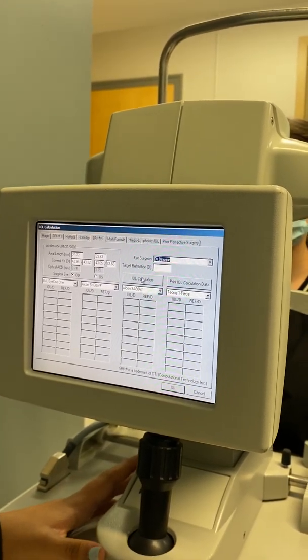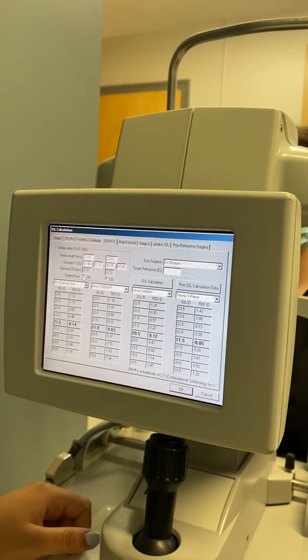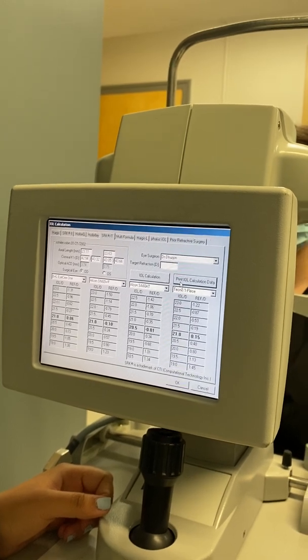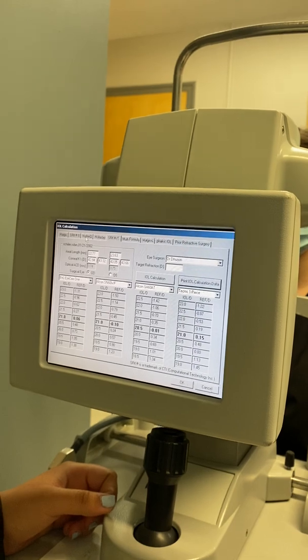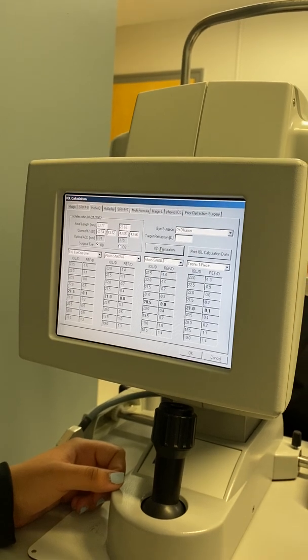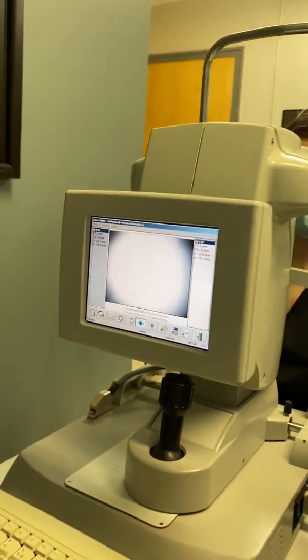So then you click on IOL calculation. You're gonna see everything fills up. Just gonna make sure that the left eye is done as well. So OD is right and OS is left. And then you hit print calculation, IOL calculation. So that's for SRKT. Now I'm gonna move on to HofferQ. I'm gonna repeat the same steps, make sure it's for Dr. Durjan. IOL calculation and print, and then you hit OK. So you're done with the IOL master now.